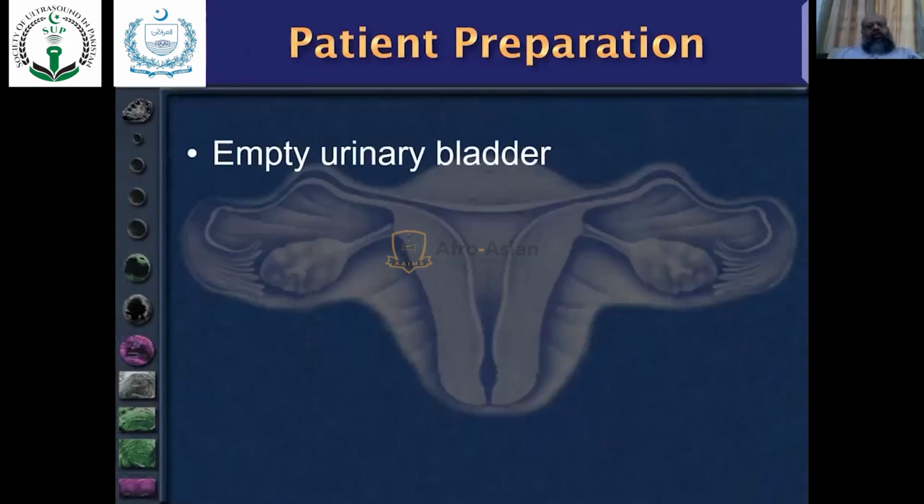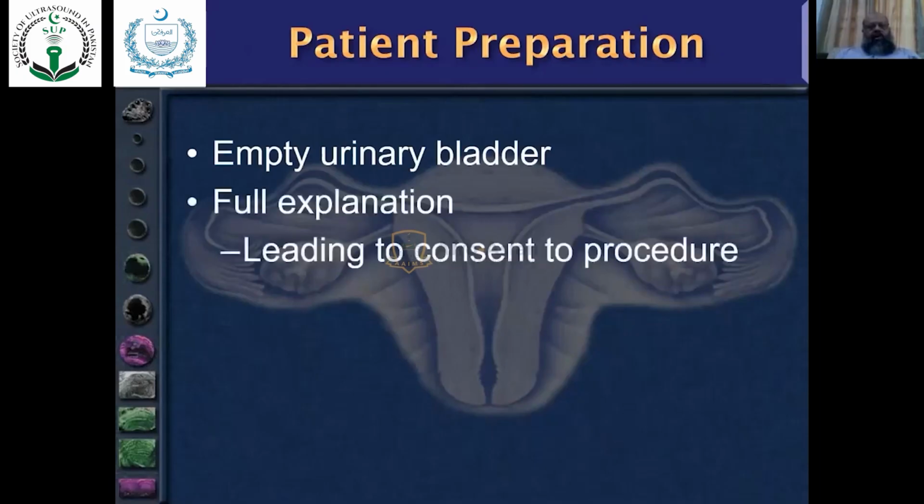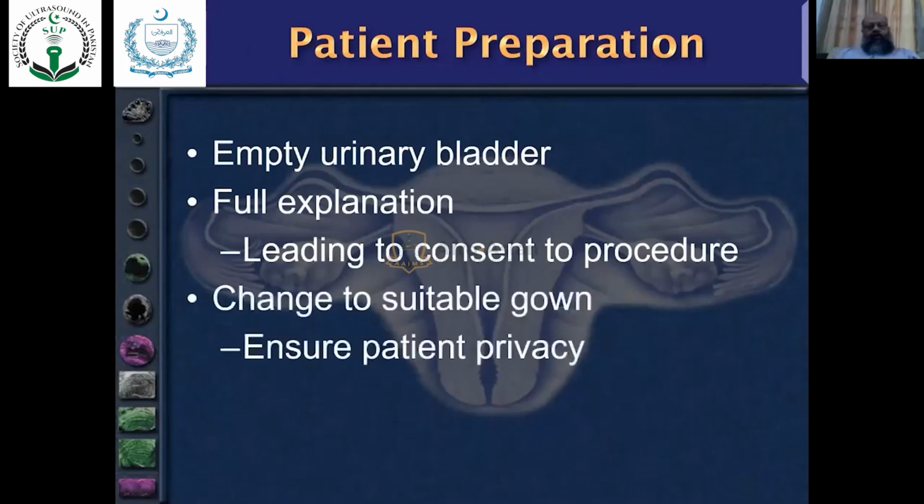Then after the transabdominal scan, we will ask the patient to empty the urinary bladder. We need to explain everything. So a full explanation of the procedure is required, leading to consent to the procedure. Better to change into a suitable gown and ensure privacy of the patient.